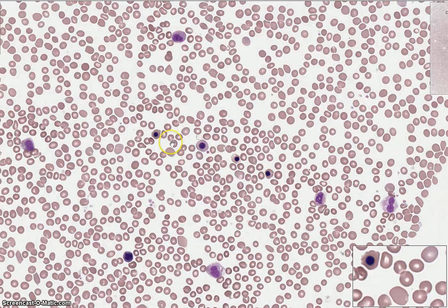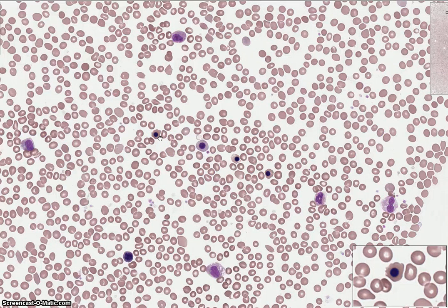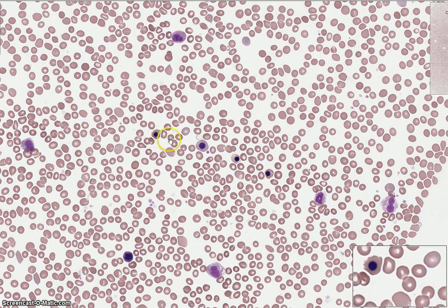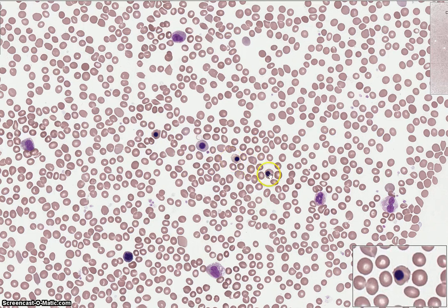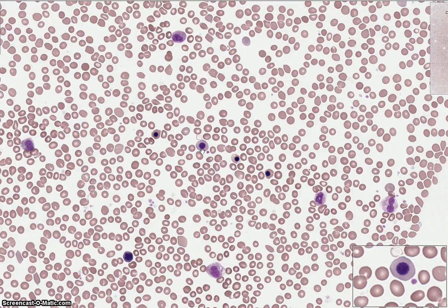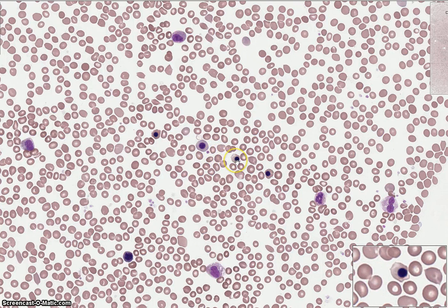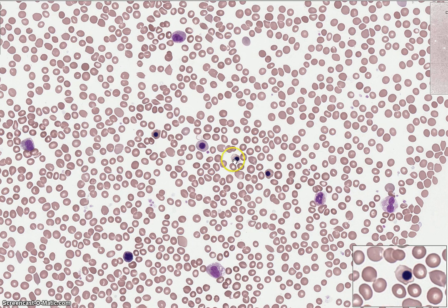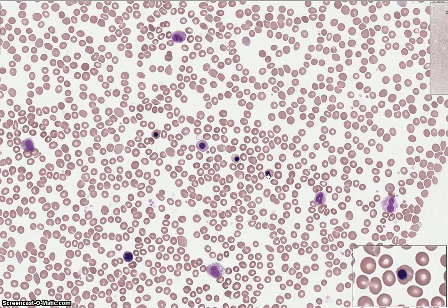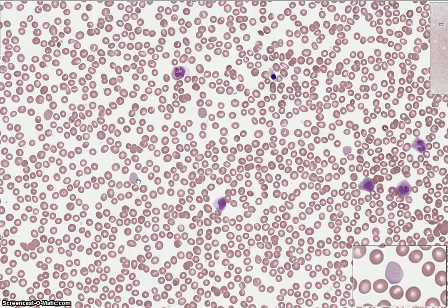There are four orthochromic normoblasts in this area — one, two, three, and four. The second cell looks more like an early orthochromic normoblast whereas the other three are later in the ortho stage. Their cell size varies but overall they're smaller than the polychromatophilic normoblasts. The cytoplasm is purple-pink in color and the nuclear chromatin is very condensed or pycnotic. In some cells the nucleus may be located at the periphery of the cell membrane in preparation to be expelled, as seen with the two cells on the right.